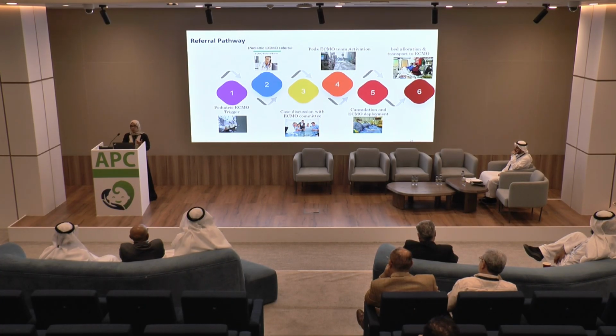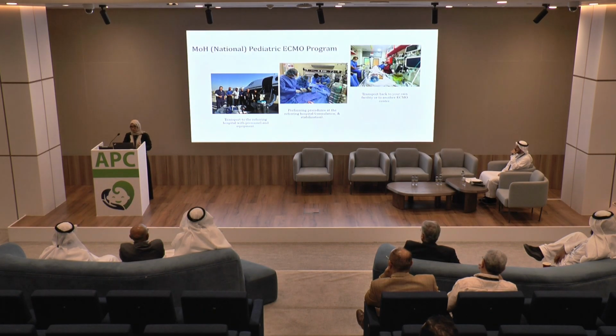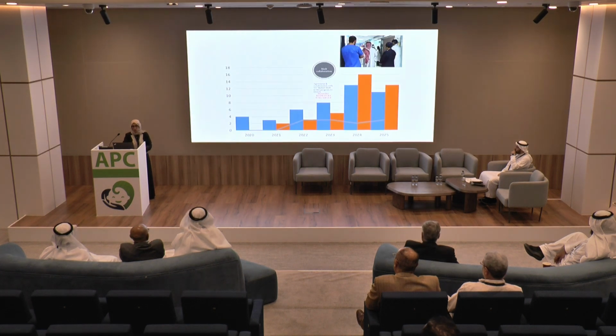The ideal is a call within an hour to provide ground transportation, and within 6 hours to have air transportation. We provided the ECMO at the referring hospital, then took the patient back to the center. We provide parallel education to all centers who are interested in maintaining or developing those programs.